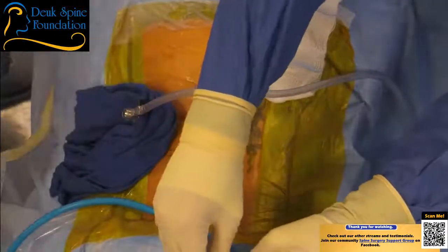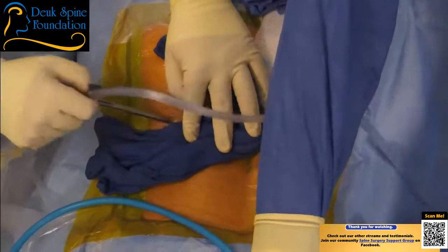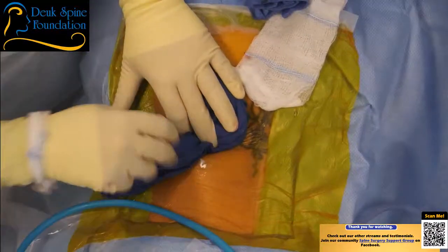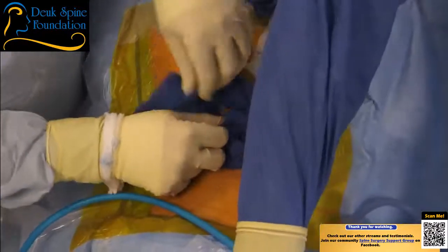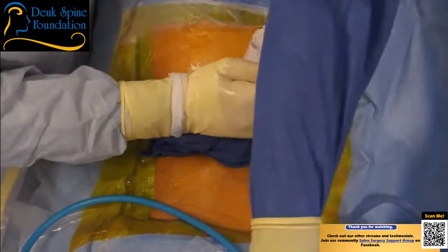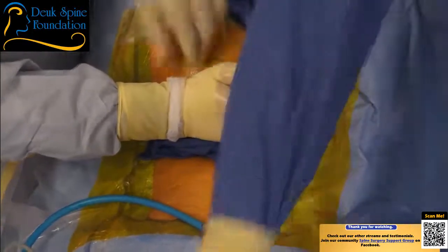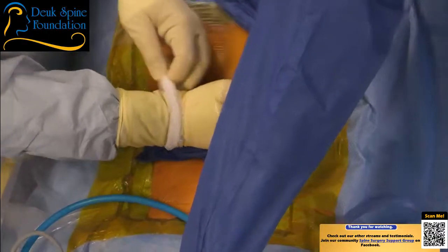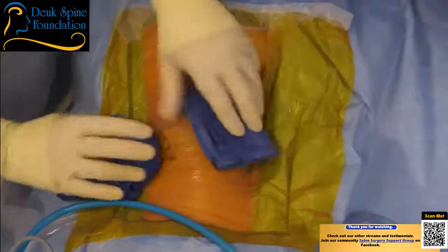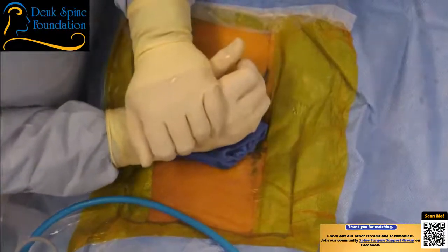Folks, I'll show you the incision that we did everything through. You're all done. We're done. You did great. I know, it's a little uncomfortable. I'm sorry. I'm just applying some pressure to keep it from bleeding. I don't think it's going to bleed, but just in case it does. You did great. All right, Sean, you ready to see this incision?